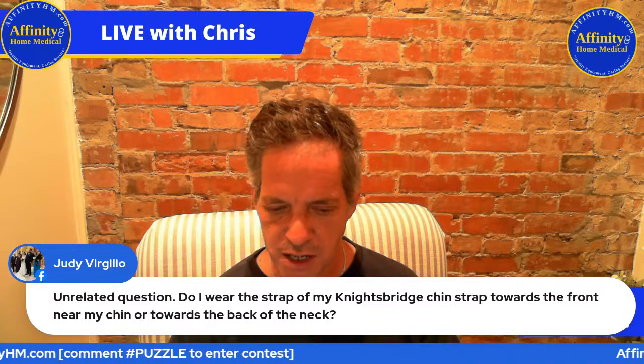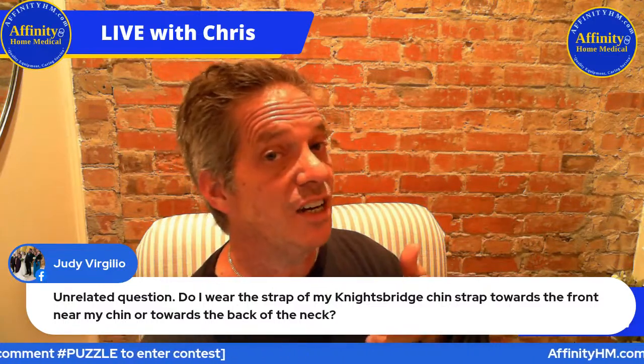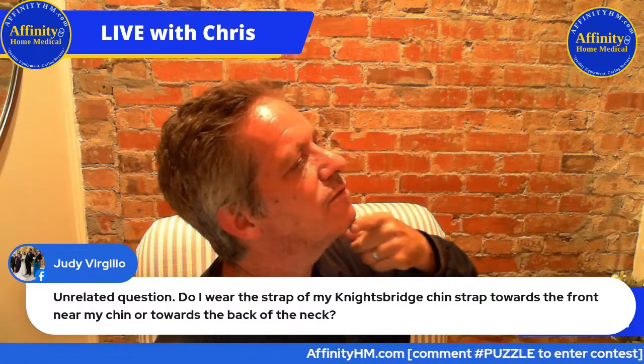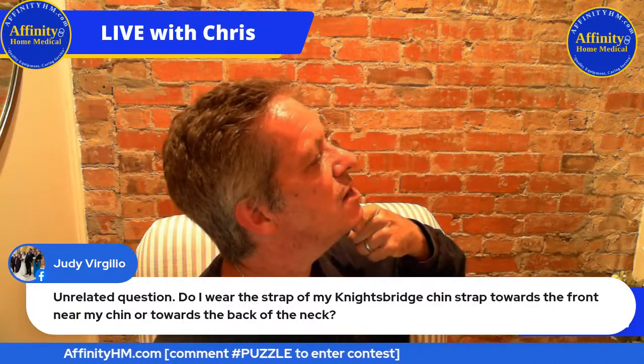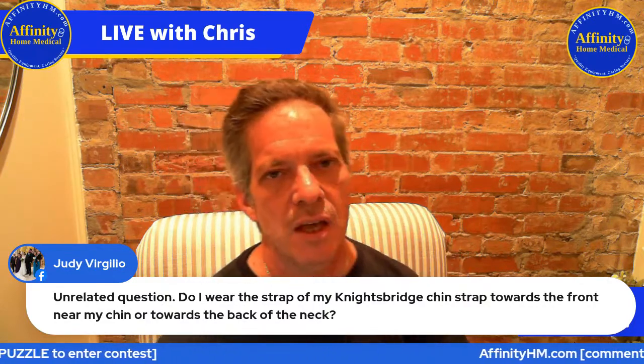Unrelated question from Judy. Do I wear the strap of my Knightsbridge chin strap towards the front near my chin or towards the back of the neck? All right, so if I understand that question correctly, I'm going to turn sideways so you got a profile view. The chin strap of the Knightsbridge, or really any chin strap, should be right here comfortably, kind of the front of the material should be probably right about at the pinpoint of your chin and extend through here, something like that.